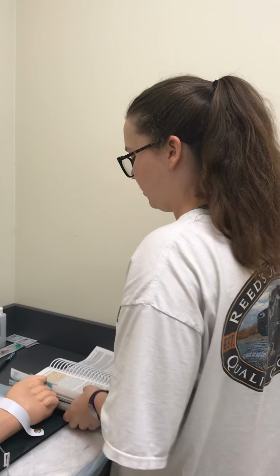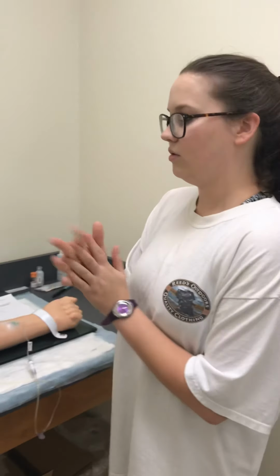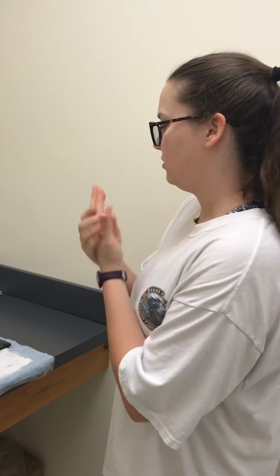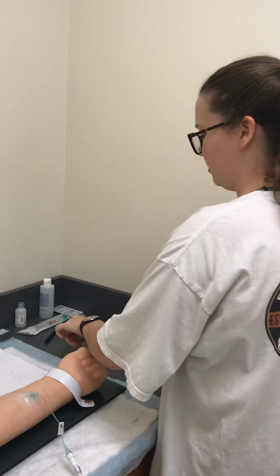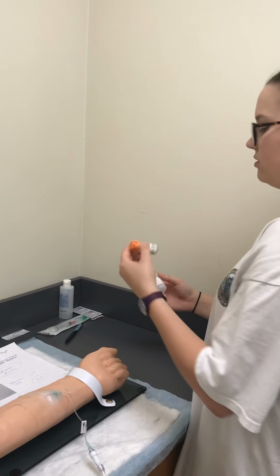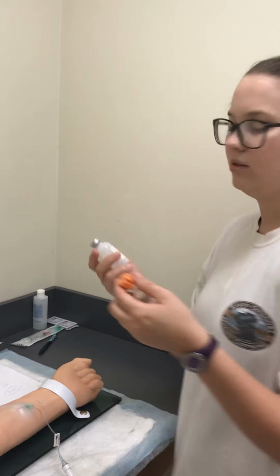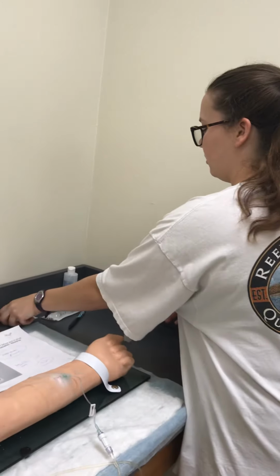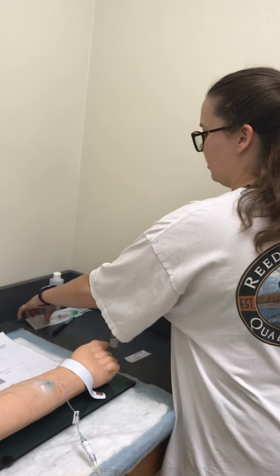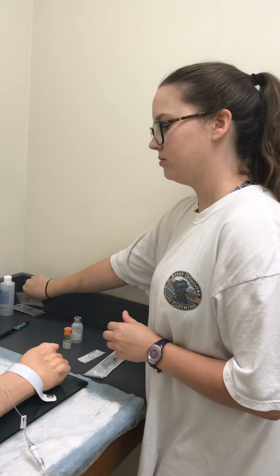So now I'm going to prepare my equipment. I'm going to wash my hands. I'm going to gather my medication, my diluent. So I have a Solumedrol. I'm comparing to the MAR, making sure I have the right medication. So Solumedrol, normal saline. I have a label. I'm going to get a 3 milliliter syringe. I'm going to get 2 alcohol swabs.